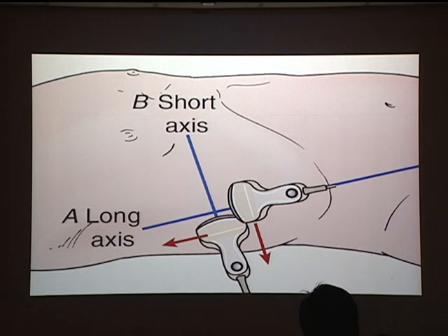To image the right kidney, you place your probe in the coronal plane of the patient, about the mid-axillary or anterior axillary line at the level of the xiphoid process. Here, maybe you need to rotate your transducer 15 to 30 degrees counterclockwise to locate the true long axis view of the kidney, because the kidney is located obliquely.